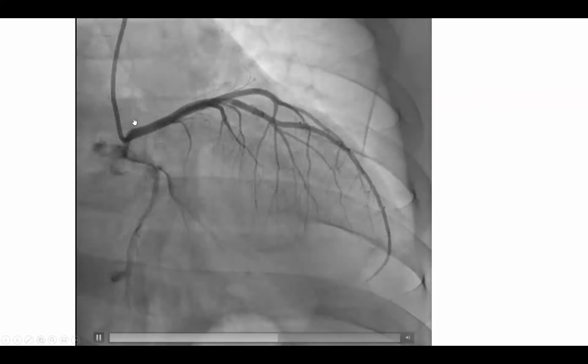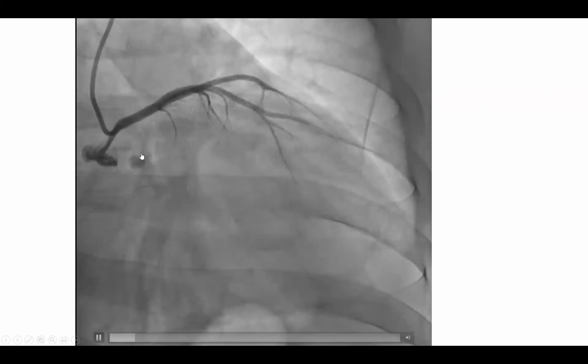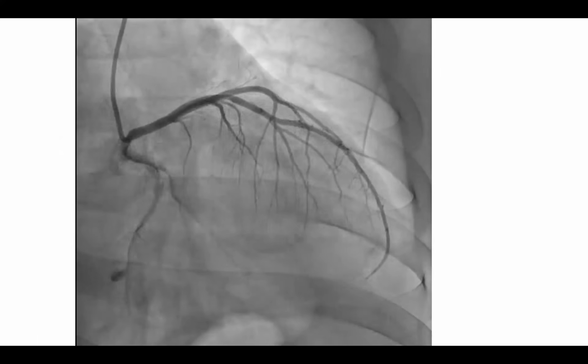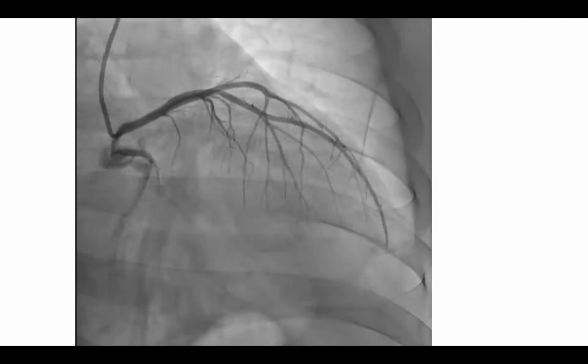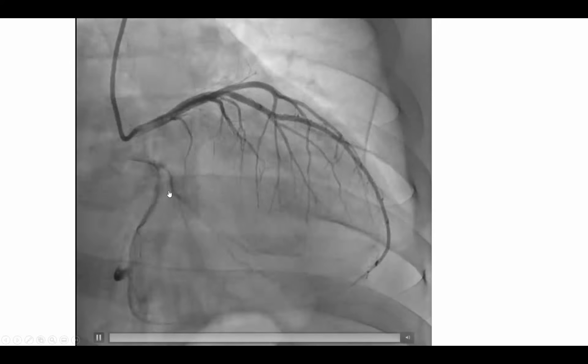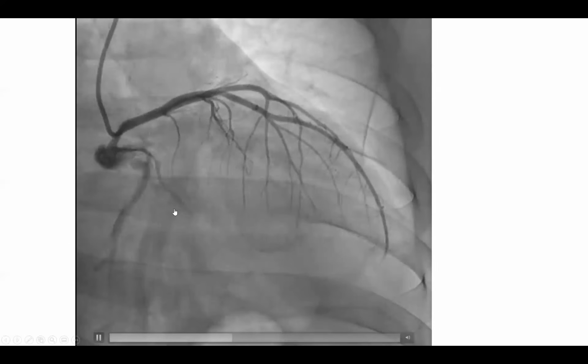That's the downside of radial. Pulling and trying to do clock and counterclock to get into the other vessel works more from femoral in selective engagement than from radial, in my experience. Again, because radial with a breath, and when you disengage, you may fly out.